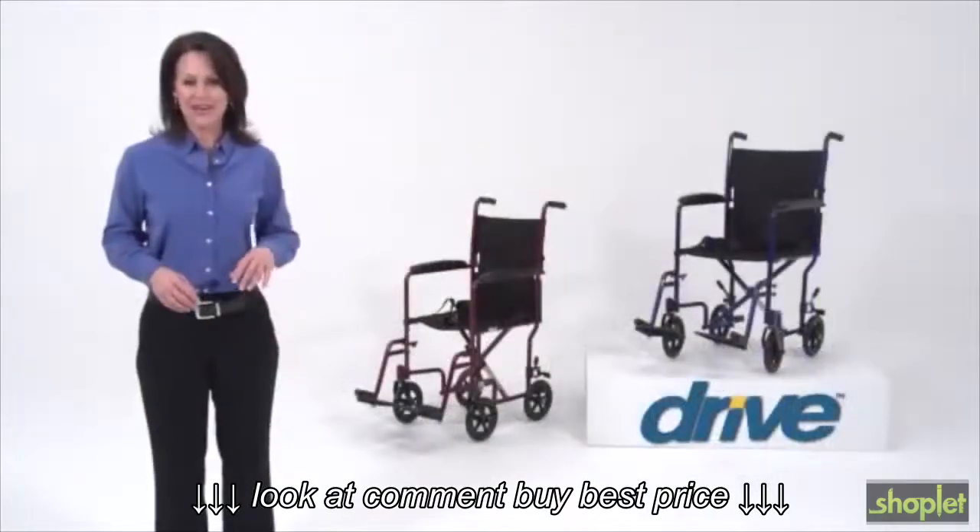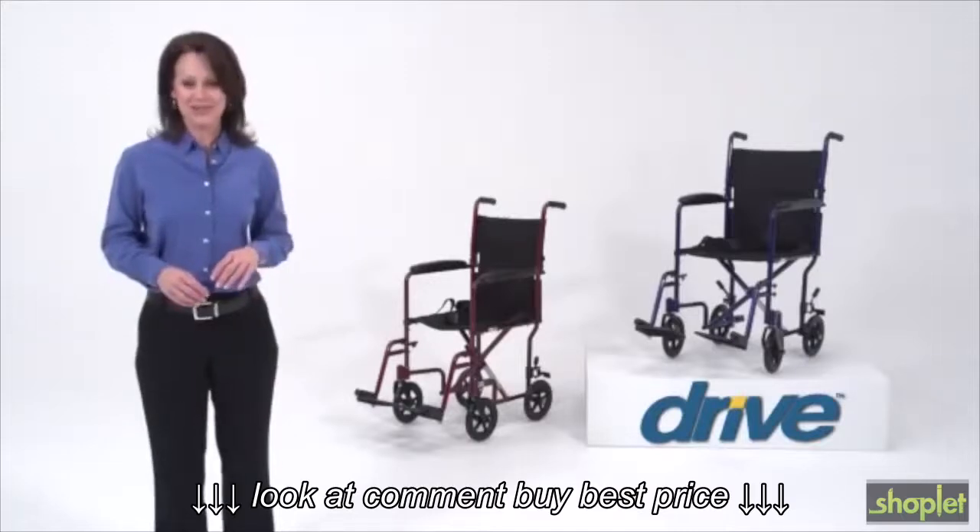You can always count on Drive Medical to bring you convenient and innovative lifestyle solutions now and for the road ahead.